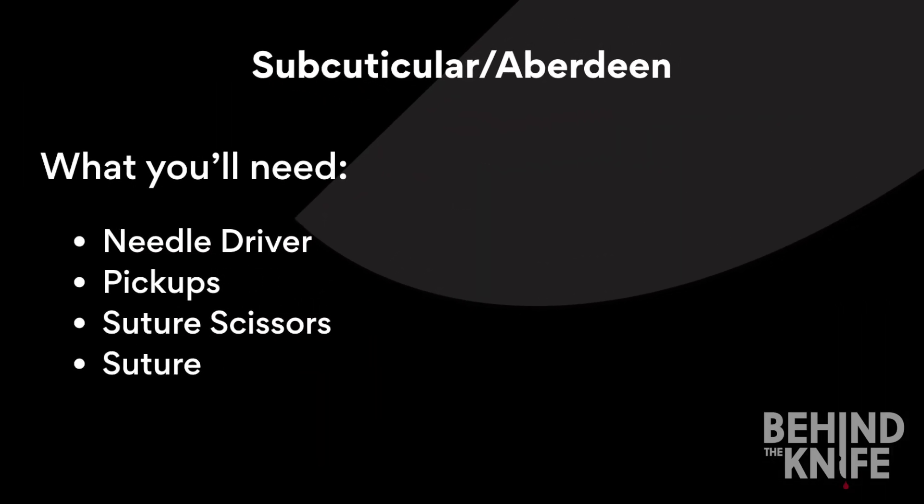Today we are going to learn how to perform a subcuticular running suture. For this you will need a needle driver, pickups, suture scissors, suture, and your behind the knife suturing board.